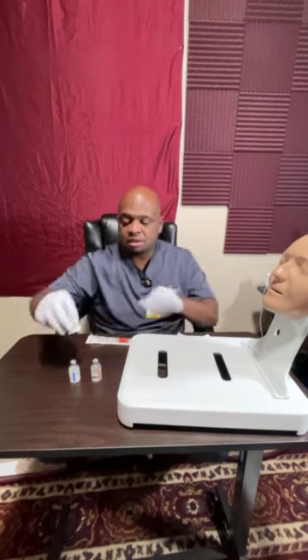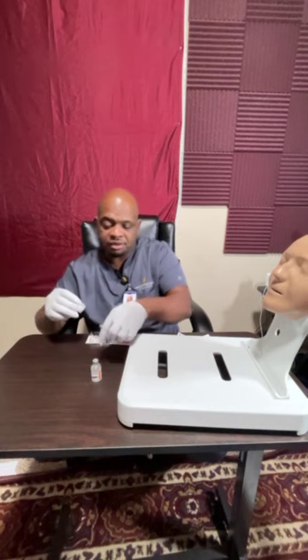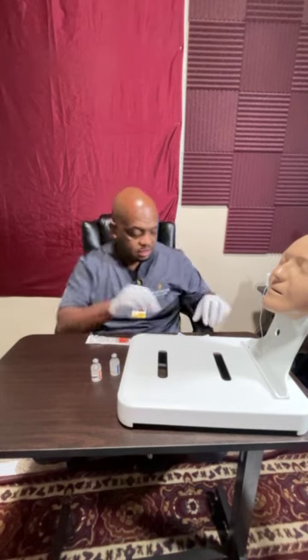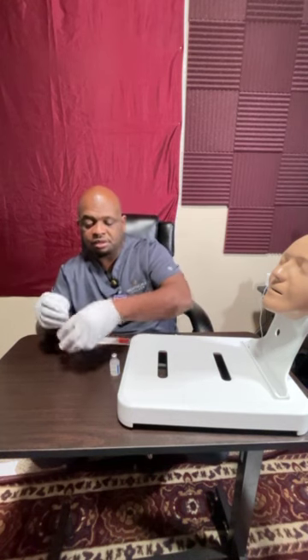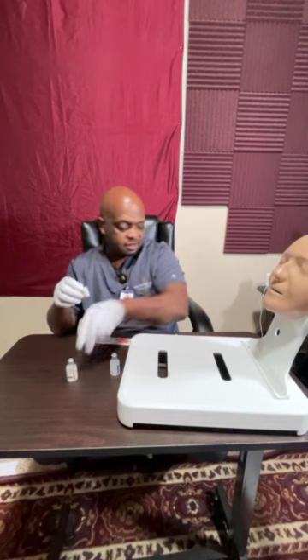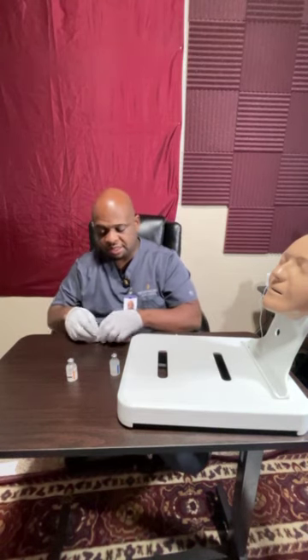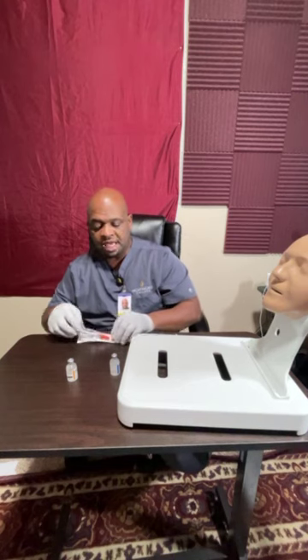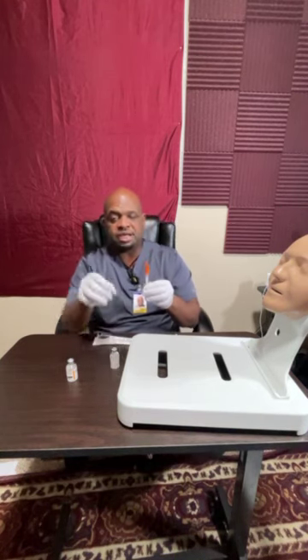I do have, as I said, 2 alcohol wipes. We're going to wipe one around the top. Let that air dry. And we're going to wipe the second one around the top. Let that air dry. The first one, what we're going to do is inject air into the NPH first.